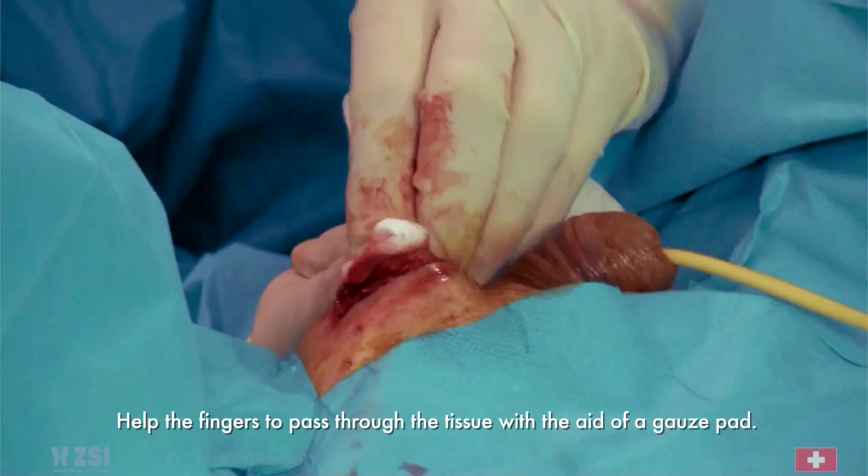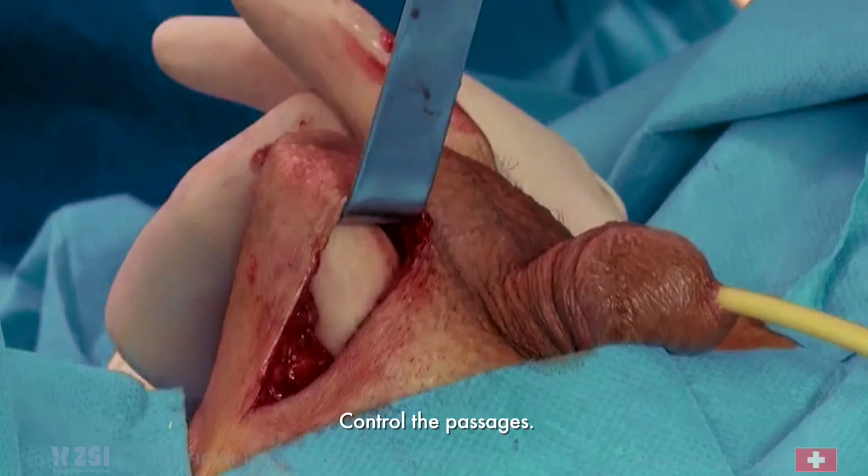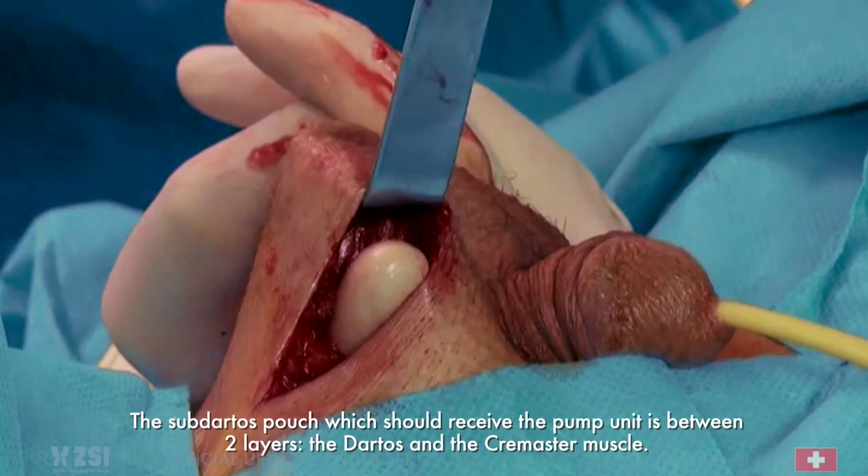Perform the passage with two fingers and control the passages. The subdartos pouch, which should receive the pump unit, is between two layers: the dartos and the cremaster muscle.